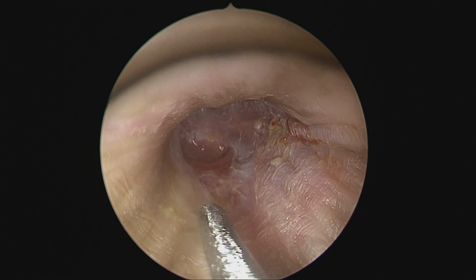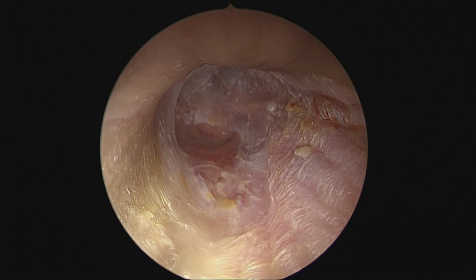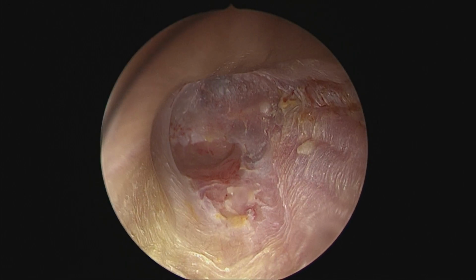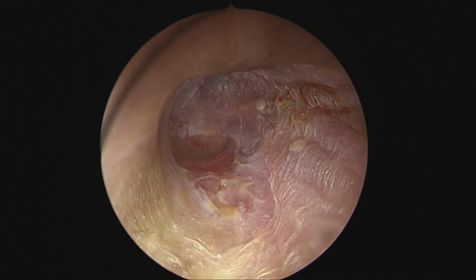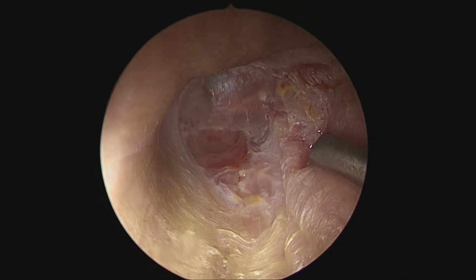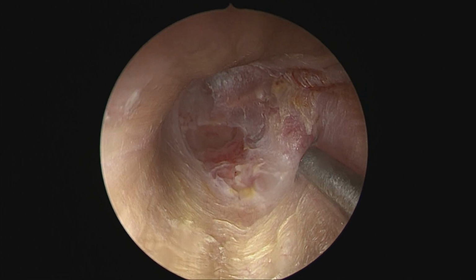As we do the minor suction, we see this patient already has had a lot of polypoidal and granulation tissue in the preoperative period and purulent discharge, which grew pseudomonas on the cultures. She has had 2 weeks of culture-appropriate antibiotics as well as topical medicines. And this is now the picture post that. So we begin with elevating our canal skin flaps in a standard manner.